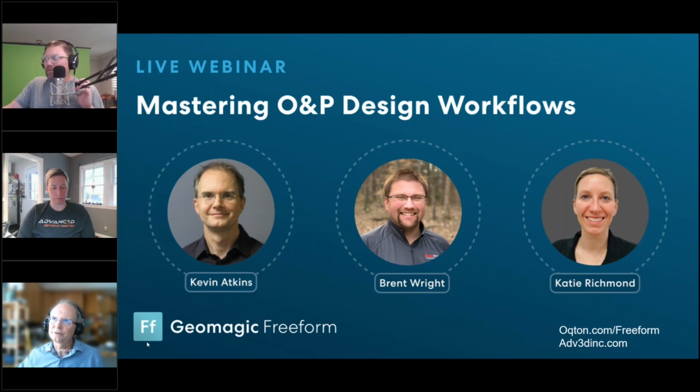We definitely do support AMD as well, both CPU and GPU, but we do see better results with Intel CPUs and NVIDIA GPUs. Yeah, and this is right. Where it hit us the hardest was actually on the scanning side of things. So we love ArtTech for the scanning side.